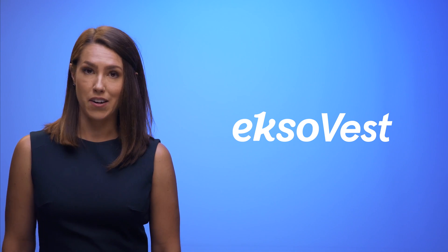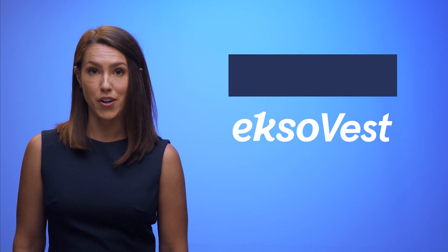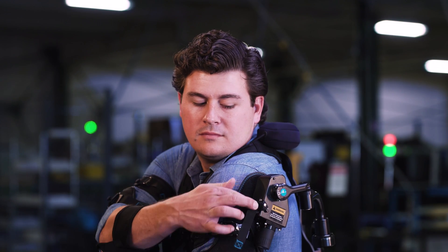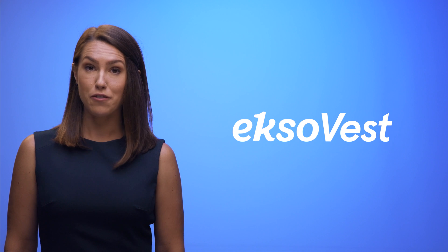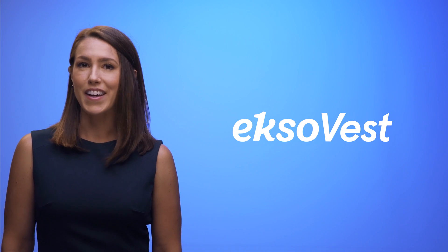To turn an actuator on or off, place your arm at your side and pull the tether to flip the switch. When you turn the actuator on, you're just unlocking the springs. If it's easier, you can grab the tether first and then place your arm by your side. As you raise your arms, you'll feel the assistive boost of your ExoVest. Now you're ready to get to work.